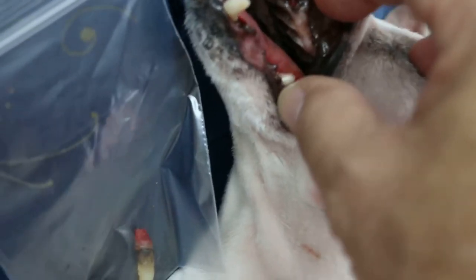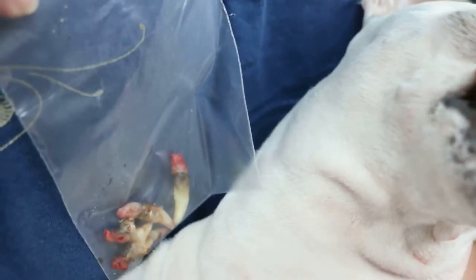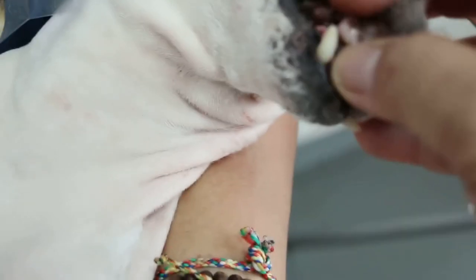The other one, this is the one. It's quite loose, so might as well extract it. Extracted out already. If you don't extract it, it will be very smelly. His mouth, his teeth are badly decayed. It's loose, so we have to extract the upper canine. His teeth are also deep, very loose. Otherwise, you poke the lower part.